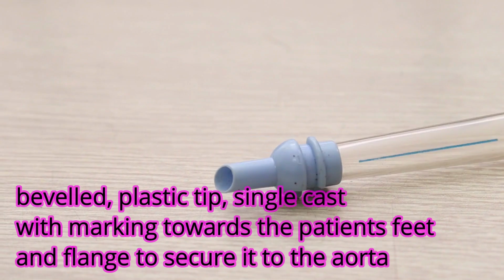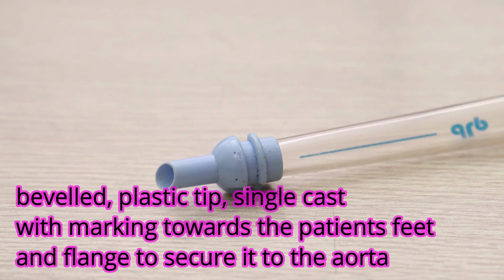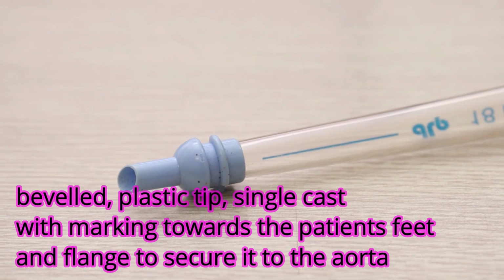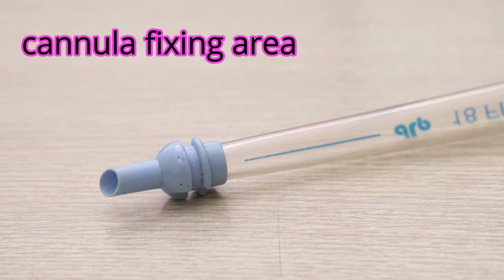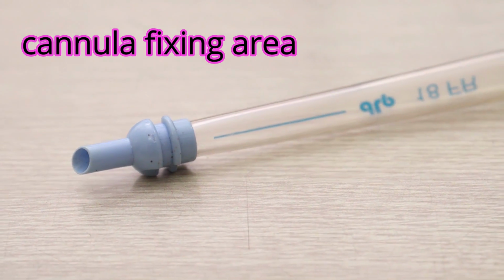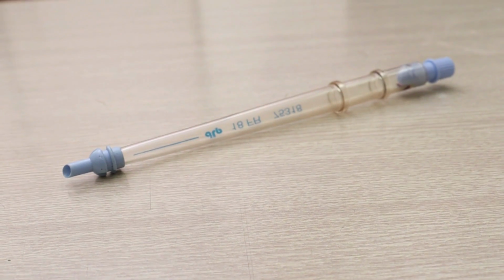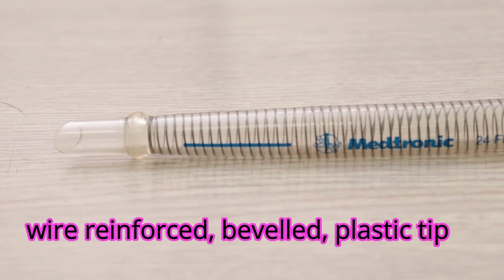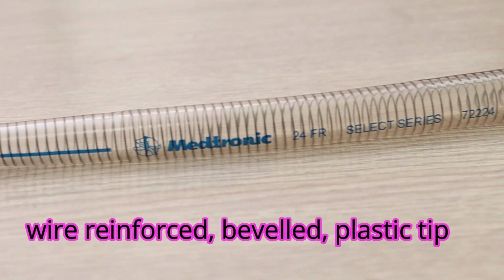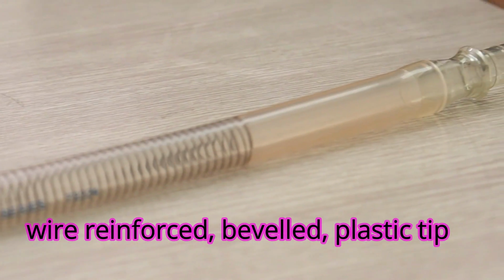Beveled edge means jet flow, a bit higher gradient, but again this is a straight tip cannula. Let's use the posterior wall, may give atheroma shower, but again you have to fix it very carefully. There's a marker, as you can see, the marker tells you which way it has to be directed. The same thing with this cannula as well. Marker tells you which way the cannula has to be directed, only difference being this is wire reinforced.